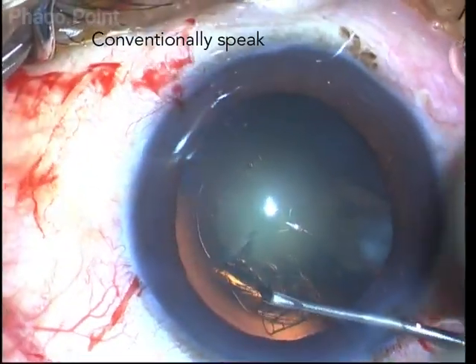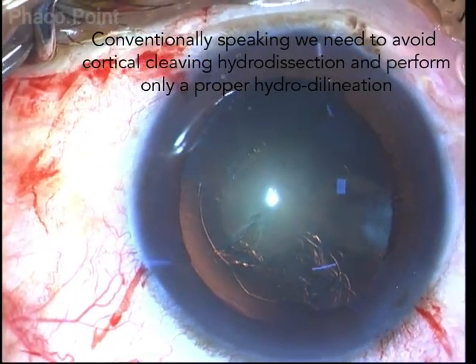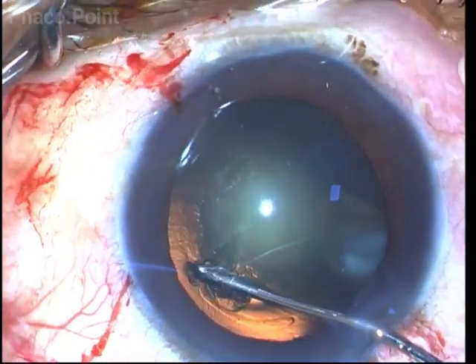The biggest pressure point in the management of polar cataracts is performing an adequate and proper hydrodelineation, and in avoiding a cortical cleavage hydrodissection.